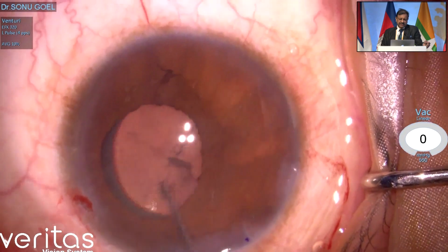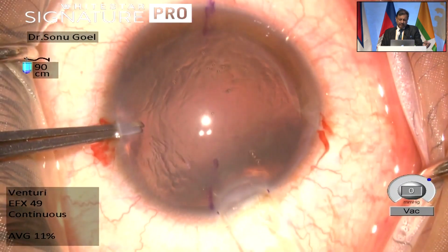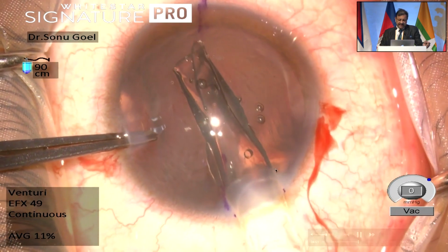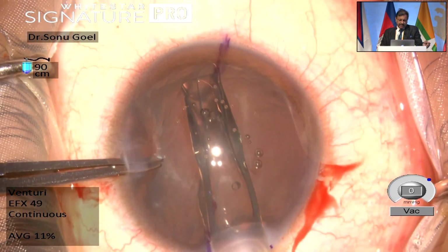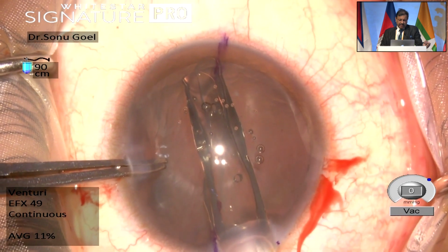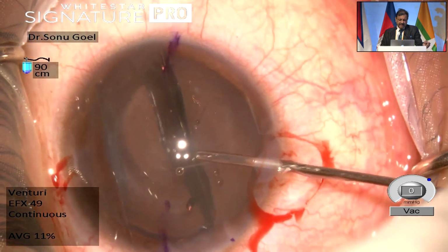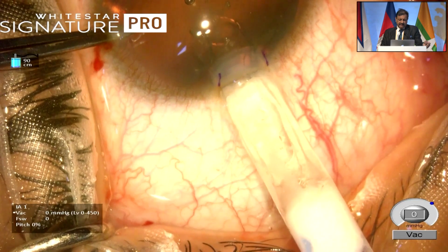Undue stress on the zonules can sometimes break them open, so be very, very gentle while pushing the ICL inside the eye. So be slow, because this lens can go either way, and yes, it's in the correct plane.